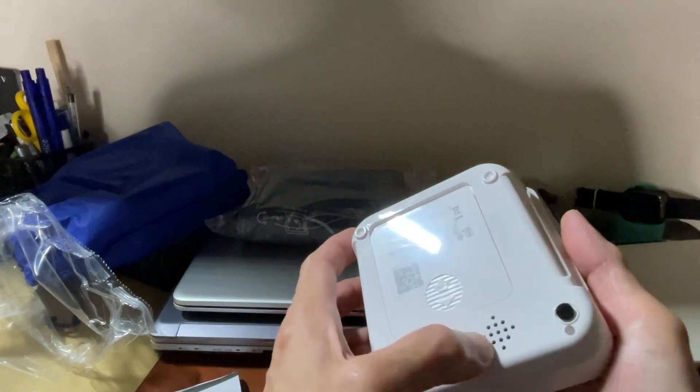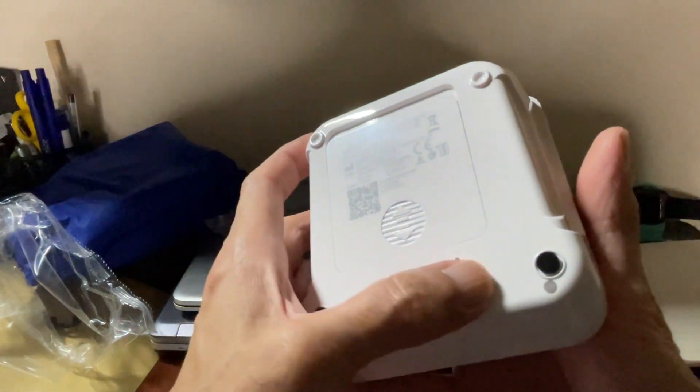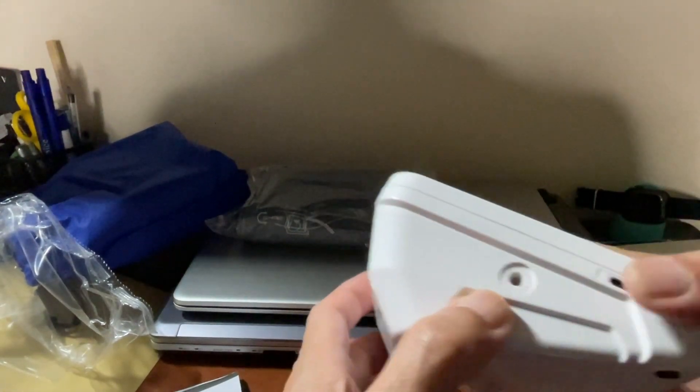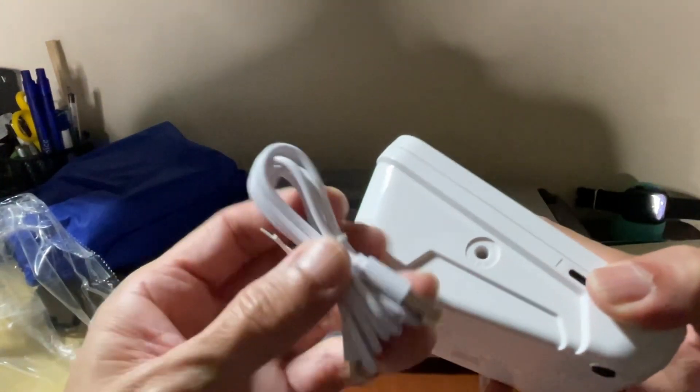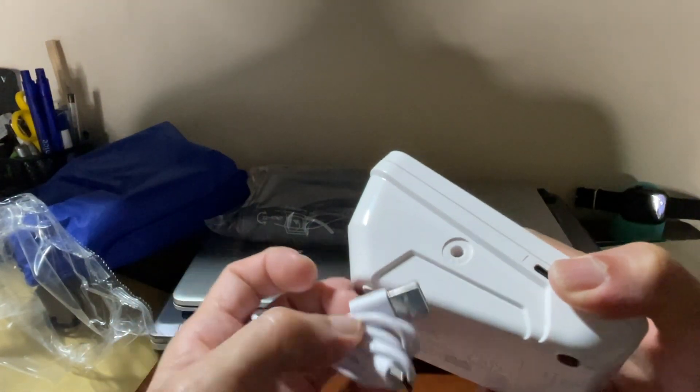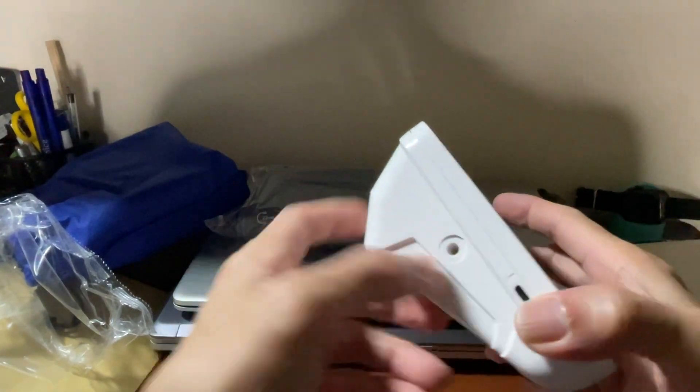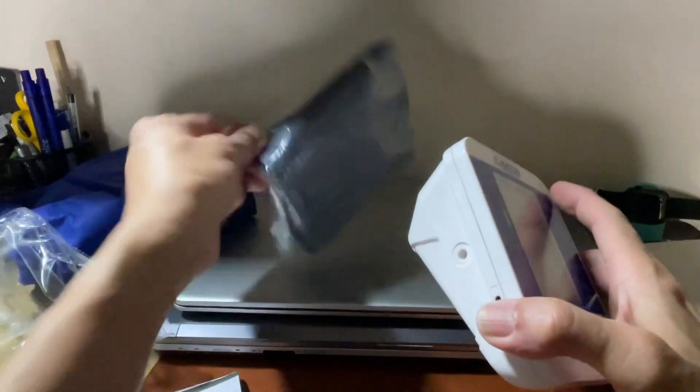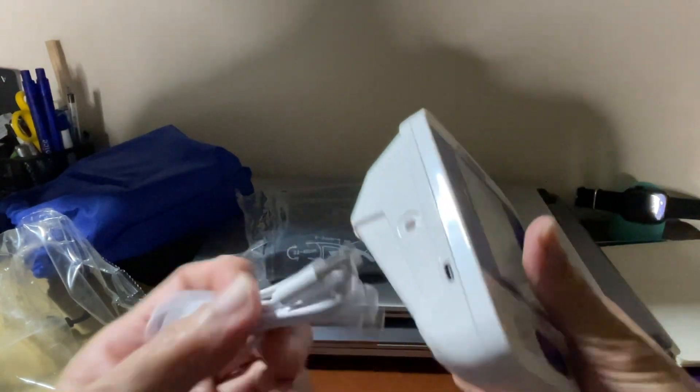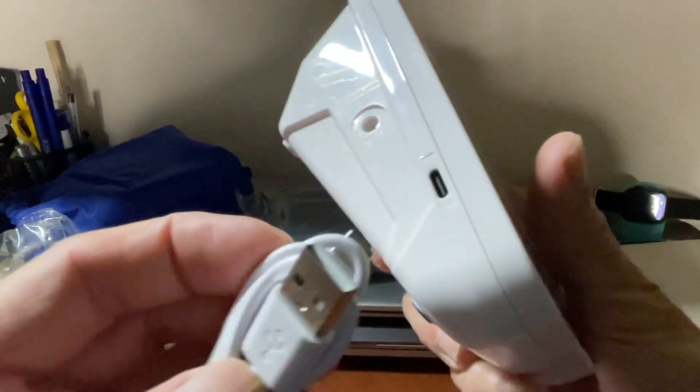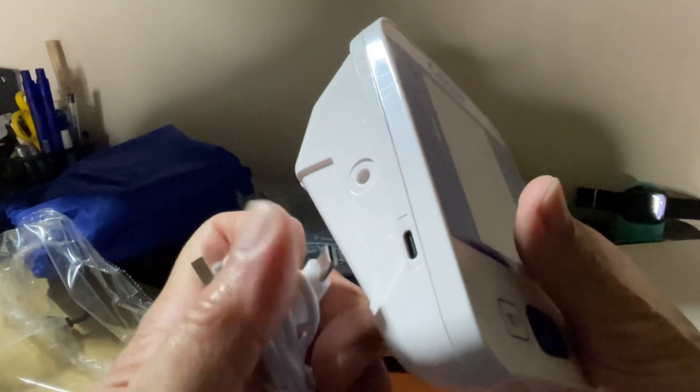It comes with a speaker on it. Here you can plug in the cuffs for the arm. And this side is where you put the type C.